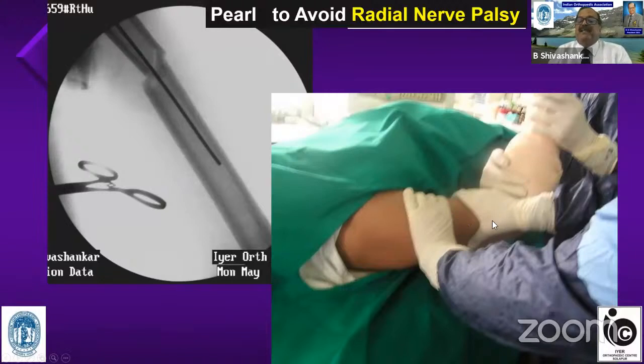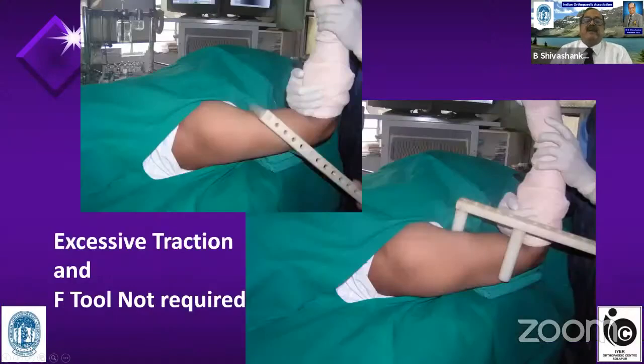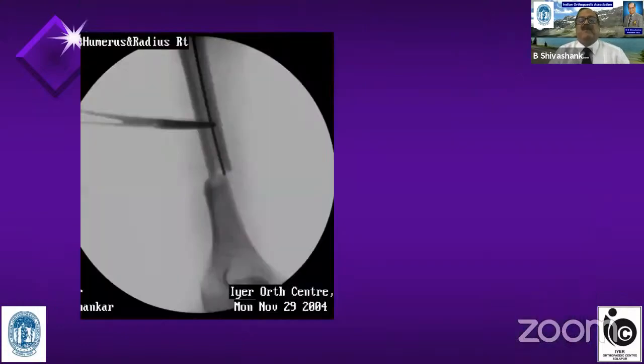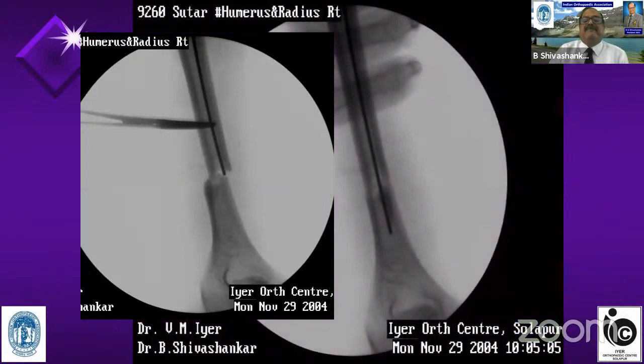And when you are manipulating the fracture, gentle manipulation is very, very important when you are passing the guide wire across the distal fragment. Better is to use the drill bit only as a joystick. As you can see in this case, I'm using the drill bit itself as a joystick and passing across the distal fragment. Excessive traction and using the tool, again a big no-no. They are all not required. Always a gentle traction just to distract the fracture site, a few millimeters, not more than that. Then you get the guide wire across into the distal fragment.